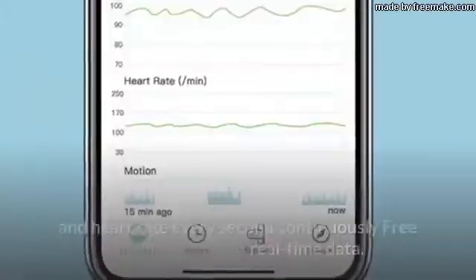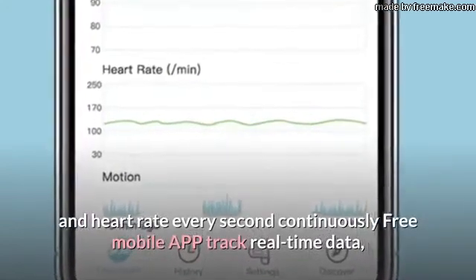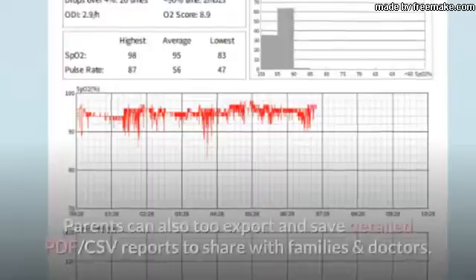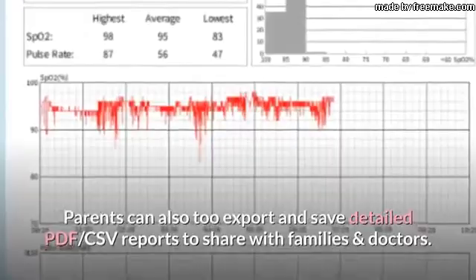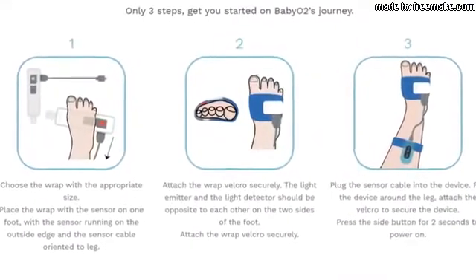Monitor, track and record oxygen levels and heart rate every second continuously with the free mobile app. Track real-time data so parents can review history recordings, check detailed reports, analysis and diagrams. Parents can also export and save detailed PDF and CSV reports to share with families and doctors.